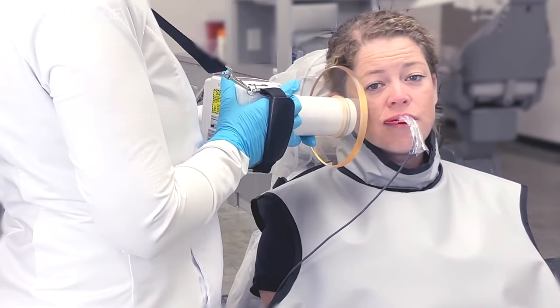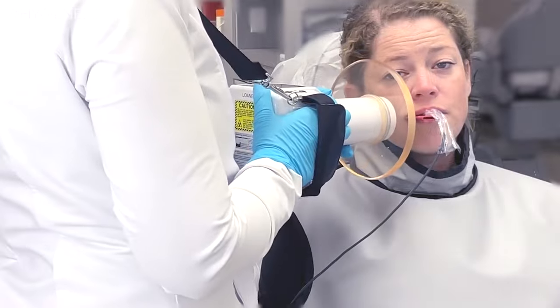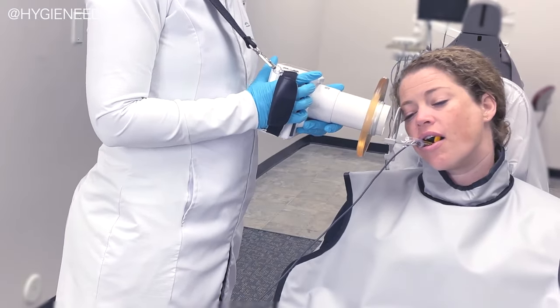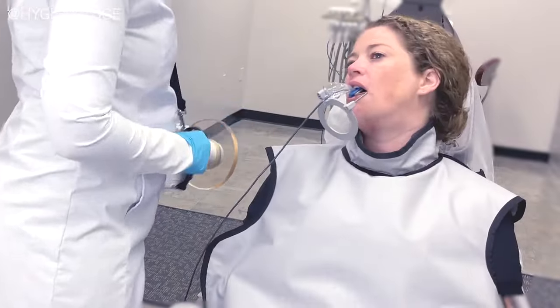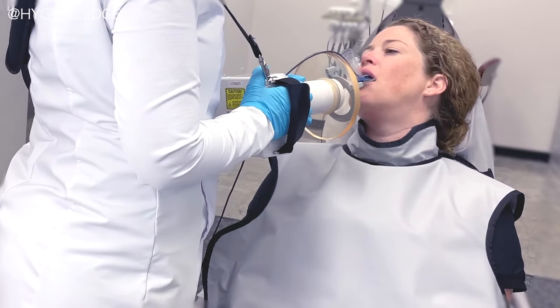For bitewings, have your patient tilt their head towards their shoulder to get that positive 10-degree angulation instead of lifting your arms to make the angulation. For posterior PAs, have the patient tilt their head towards their shoulder. For maxillary anteriors, they should tilt their head down and look left or right. And for mandibular anterior teeth, tilt the head up. It may also be helpful to have them rest their head on the headrest if needed.